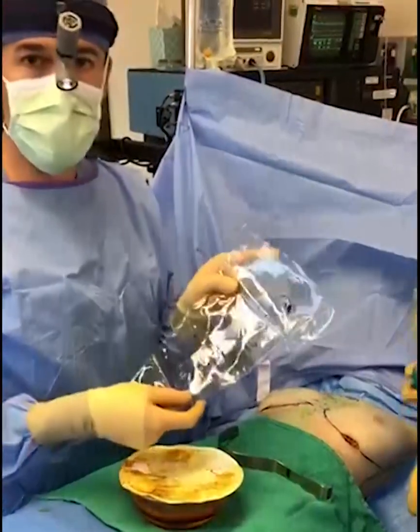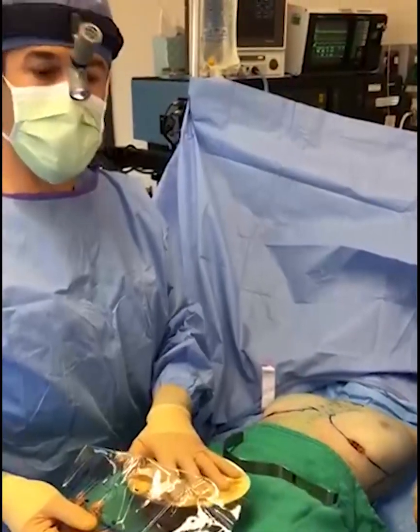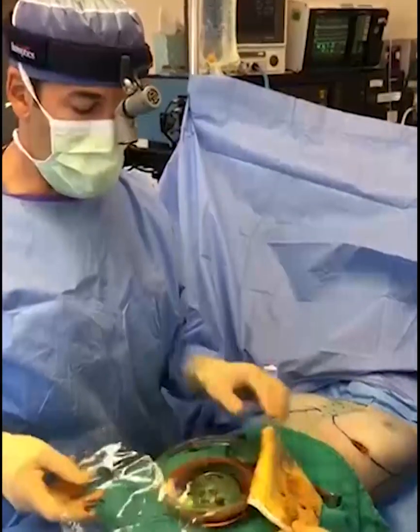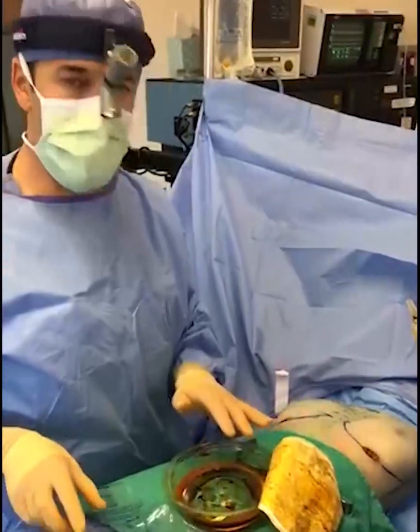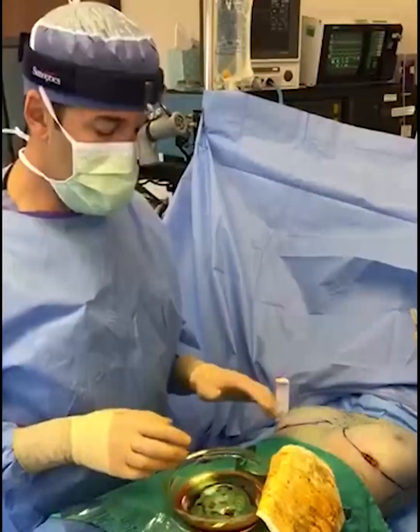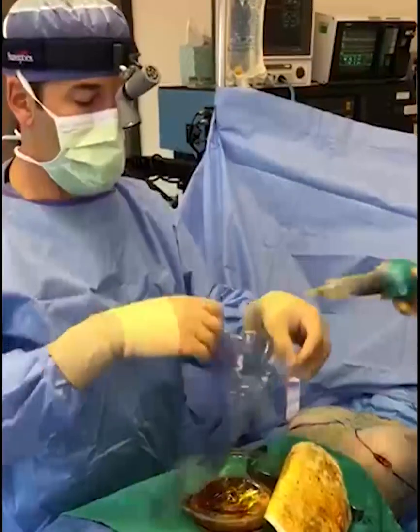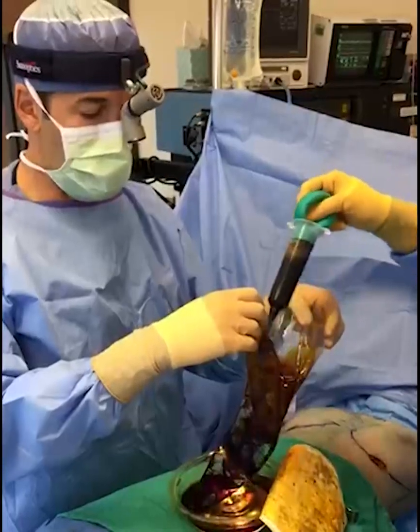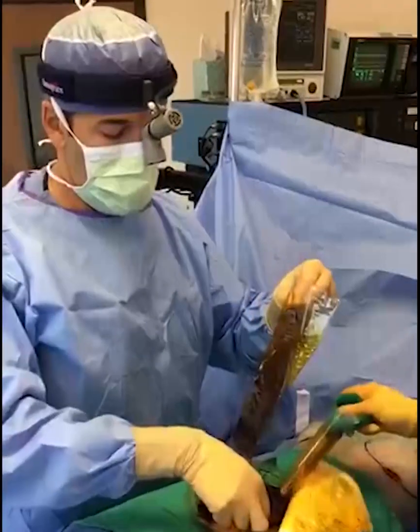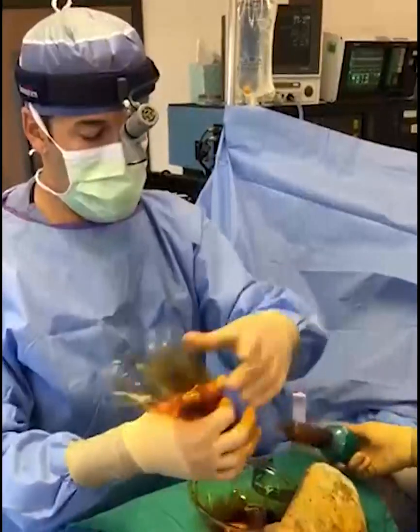So we're going to be using the Keller Funnel, and we're going to be using the 330cc SSM, which is the soft touch implant made by Allergan. I like to soak all my implants in triple antibiotic irrigation and betadine. I've changed my gloves. We've re-prepped everything. So these are clean gloves. And now we're going to just prepare the funnel with the same solution. And then the implant just simply goes into the funnel, taking care to know the orientation.